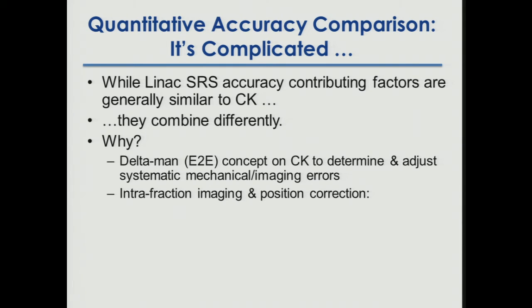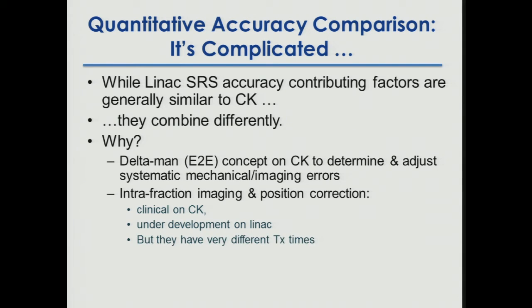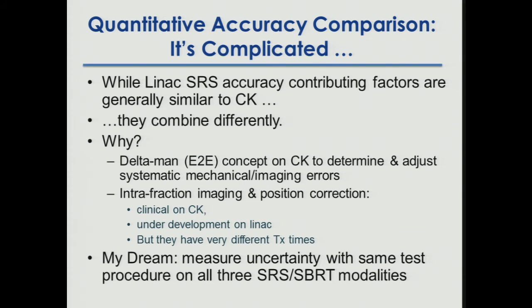There's intrafraction imaging and positioning correction, which is clinical on the CyberKnife, under development on the Linac, where there are centers which are very far ahead that have intrabeam imaging, either optical, like UC San Diego, Laura Cervino does, or other intrabeam imaging. But there's a wider spread of clinical practice on a Linac. And we have very different treatment times, so that also factors in. Linac treatment times for stereotactic radiosurgery can range from a single arc that's done in 2 minutes to a complicated IMRT delivery that takes, with breath hold, half an hour or more. So you also have a wide range here.